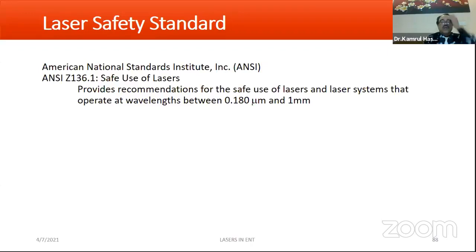Though dermatologists use it under local anesthesia as only the superficial area is treated, there is still a chance of burning of the tissue and complete removal of tissue by evaporation. But in otolaryngology we prefer general anesthesia. Anesthetists should be equipped for this. So what things should we know? We should know about the anesthesia technique.